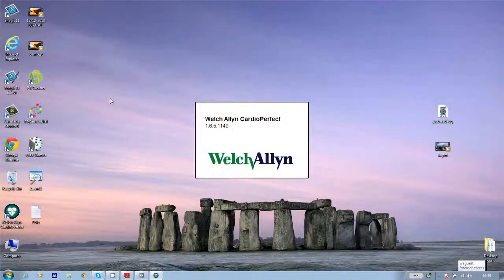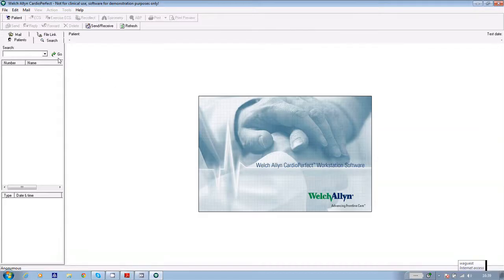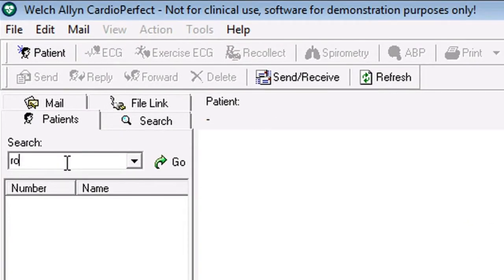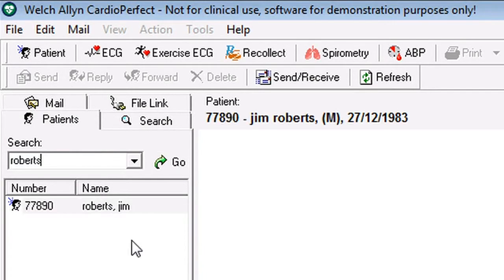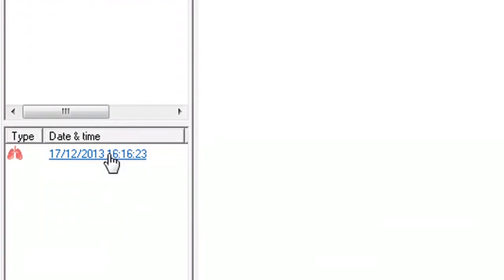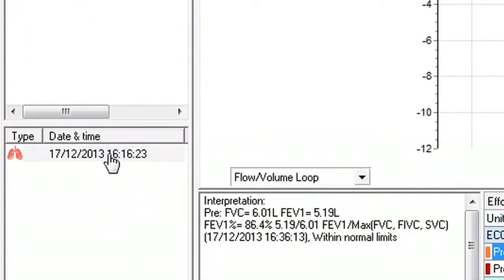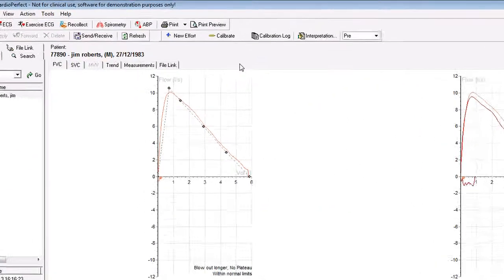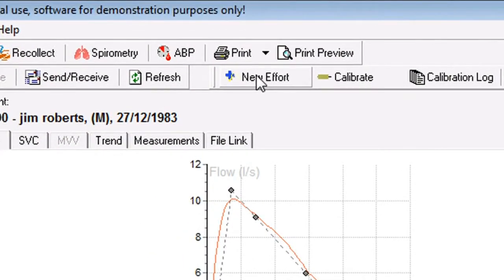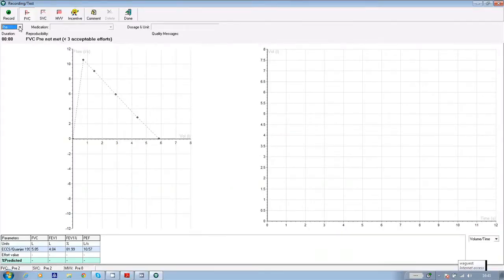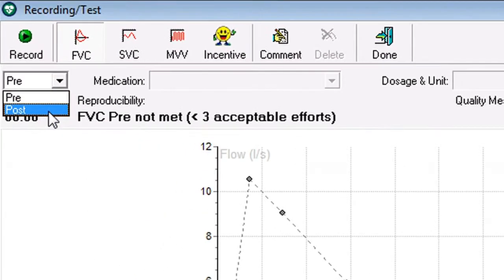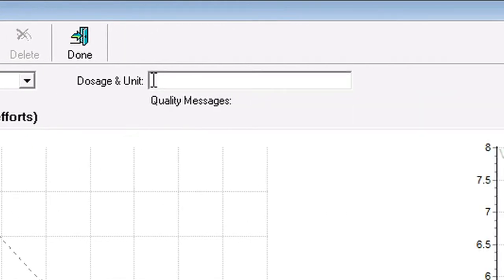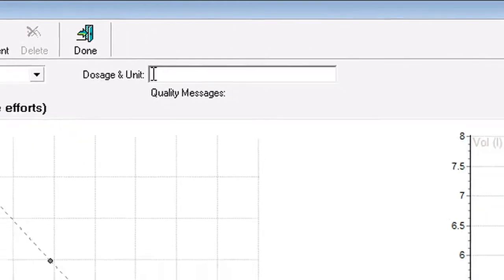If you want to perform a reversibility test after the patient's FVC, give the patient medication as diagnosed and then wait approximately 15 minutes before getting them back into the treatment room. Then go back into the CardioPerfect software, find your patient and highlight their previous spirometry test in the bottom left hand corner of the screen. At the top of the screen, click on new effort and change pre to post and enter your medication and dosage as necessary.